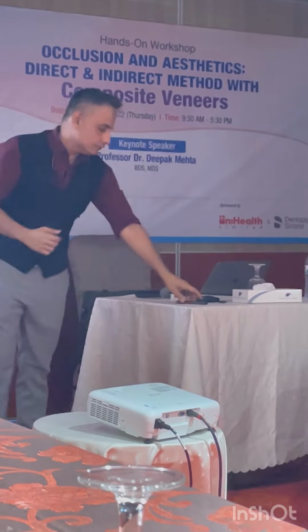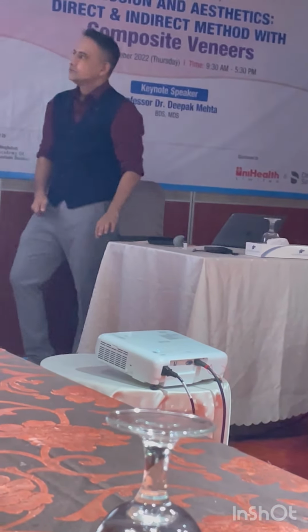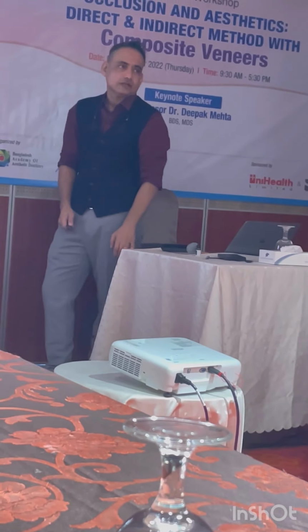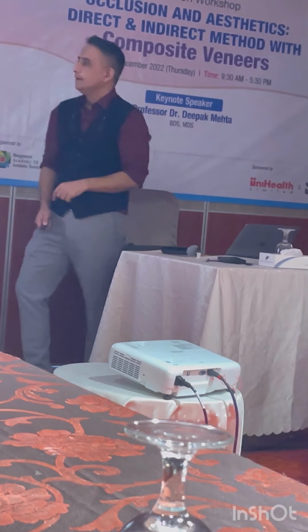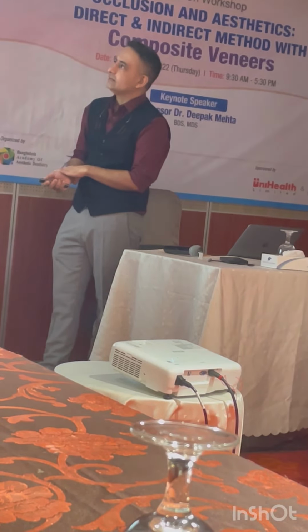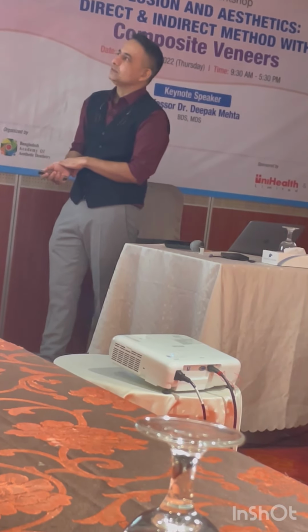So we did a beautiful composite veneer in this case, and what we did in this case was Edelweiss veneer. You see, we removed and we placed the veneer so quickly. I finished this in half an hour, which I will show you the concept today. And this is exactly how the veneer is. So completely prefabricated system. Just roughen and place this veneer on the patient's mouth.